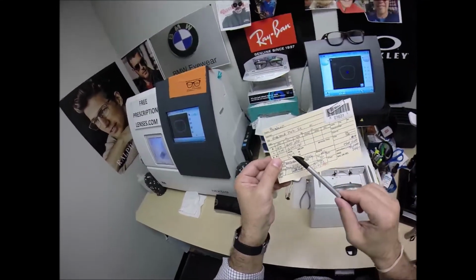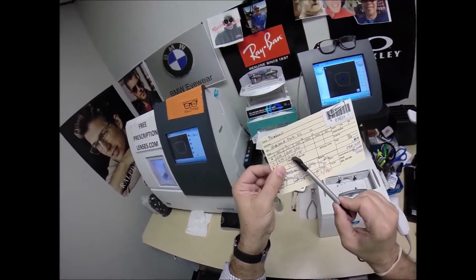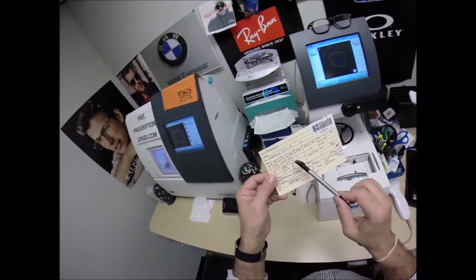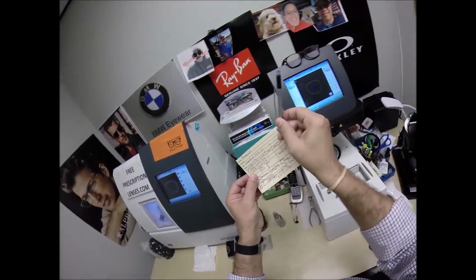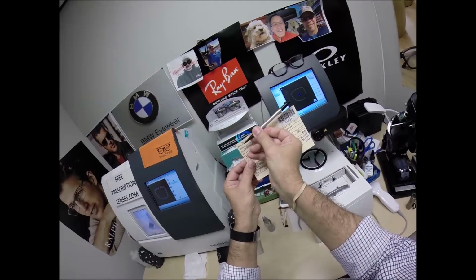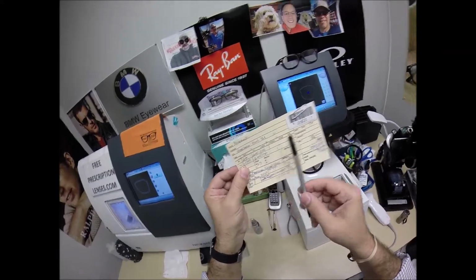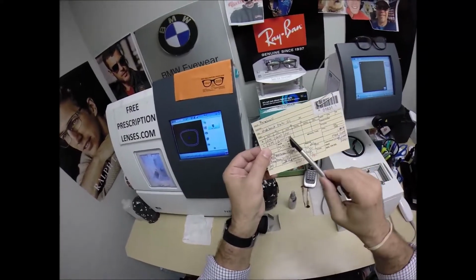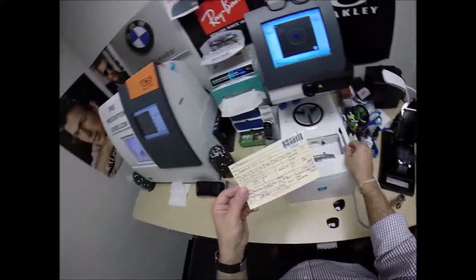You have 10 degrees. Now, your left eye needs 7 steps of far-sighted correction and another 8 steps of astigmatic correction, but we're going to turn that fine tune knob to 170. Now, what I saw that I liked earlier that I alluded to, you think 10 and 170 are far apart? No, a straight line is 0 to 180. So you're on the 10th meridian for the right eye. For the left eye, you're at 170, which is 10 degrees away from the 180. So that's kind of cool. This number could be anywhere from 0 to 180. It's just rather unique that you're 10 degrees on both sides away from the 180.